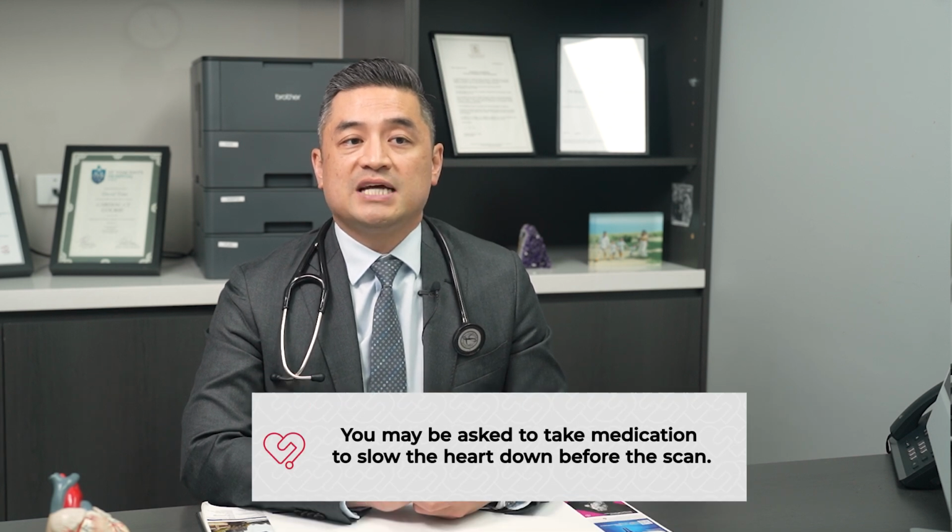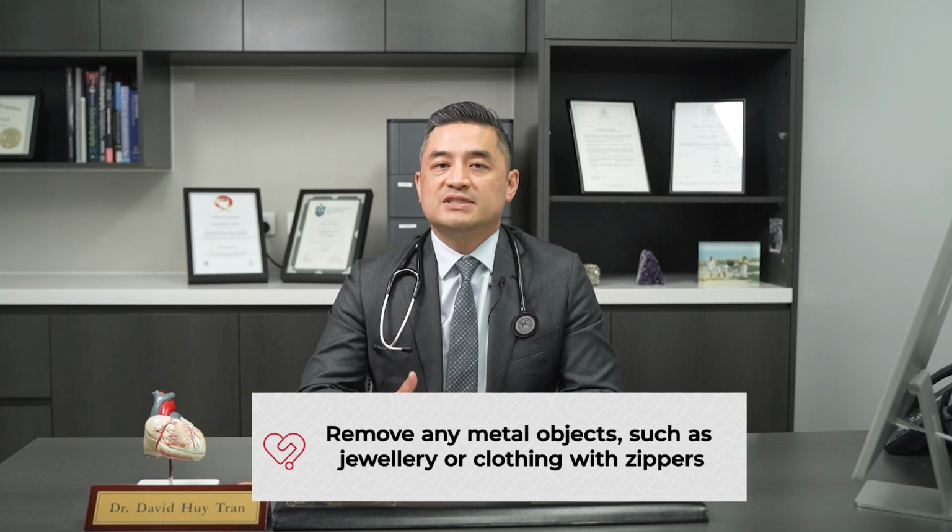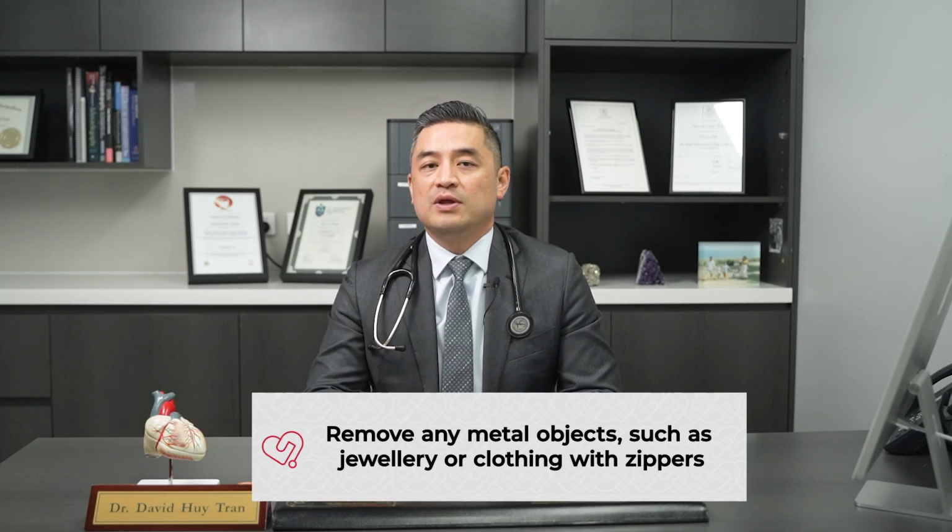You may be asked to take a medication to slow the heart down before the scan. Often it is prescribed by the doctor at the time of ordering the scan, in which case the doctor will advise on the correct dose, or it can be given on the morning of the scan. You'll be asked to remove any metal objects such as jewelry or clothing with zippers, as that can interfere with the X-ray images. If you have a contrast dye allergy or have had a reaction to contrast in the past, let your doctor know beforehand, as they may want to prescribe medications to reduce your risk of a reaction.